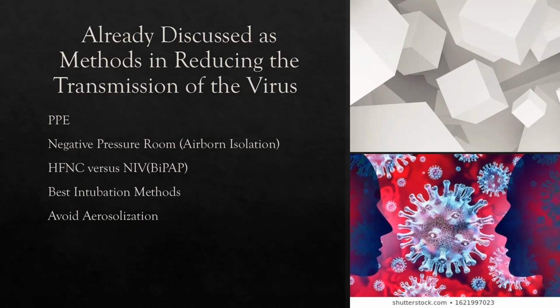I don't know if it's biased studies, but they're showing high flow cannula is better than using non-invasive ventilation. But that information came from, was it Fisher-Paykel? And the OptiFlow, that's high flow nasal cannula. So when they put out studies, should I really be quoting them? But they're claiming that patients didn't need intubation as much if they were on a high flow cannula compared to needing non-invasive ventilation.